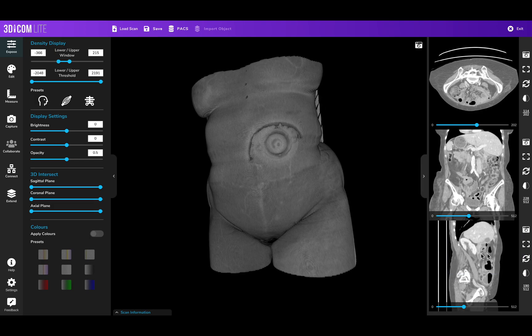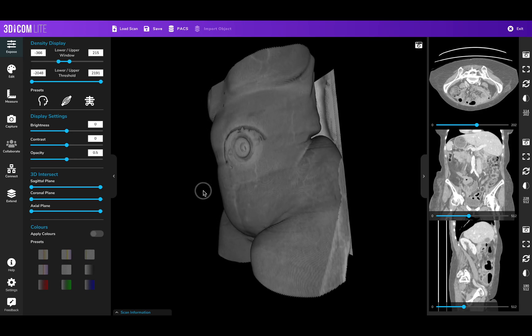These get stored at your chosen file location and allow you to quickly communicate particular slices of interest, as well as anything of interest in the 3D scan.